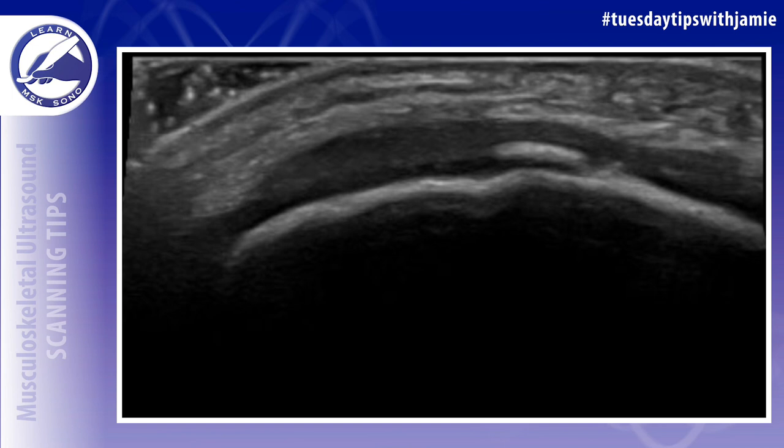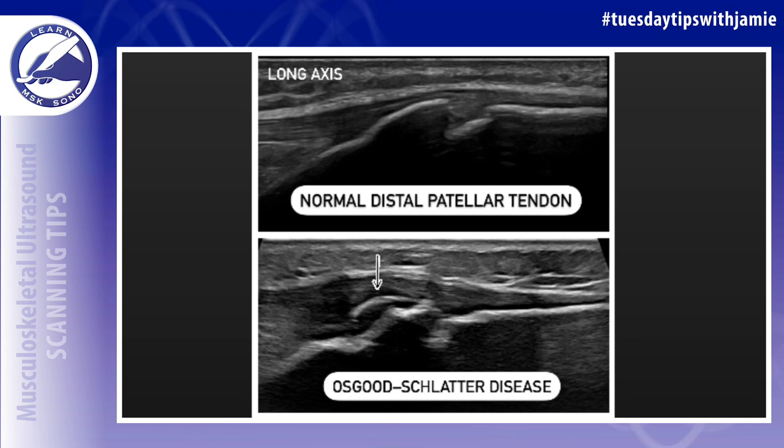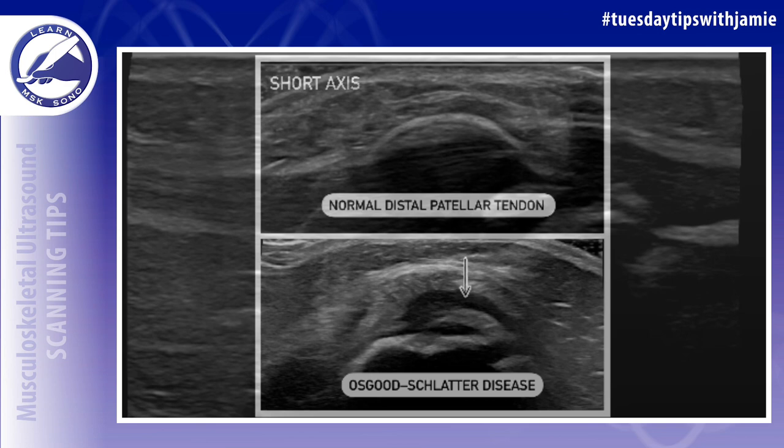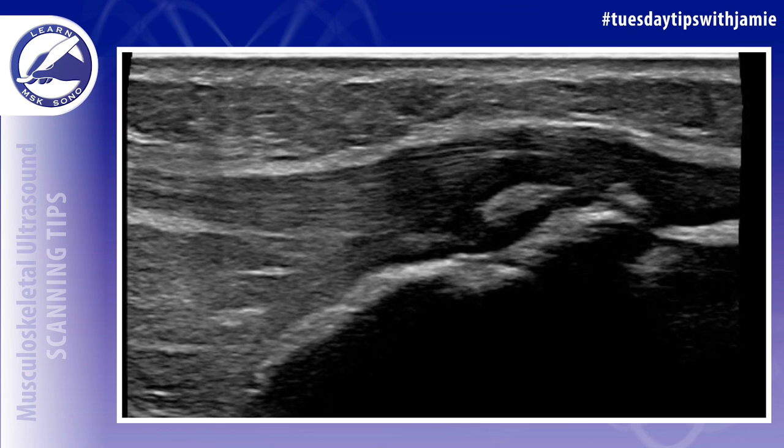Next, we have a side-by-side comparison of a normal distal patellar tendon compared to one with Osgood-Schlatter disease in the long and short axis. Osgood-Schlatter disease affects the anterior pole of the tibia at the distal end of the patellar tendon insertion.